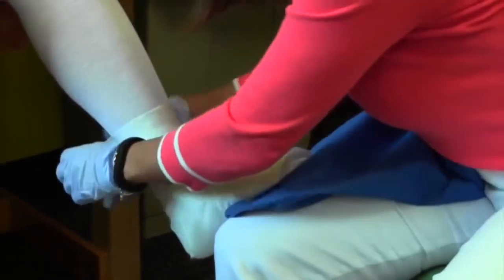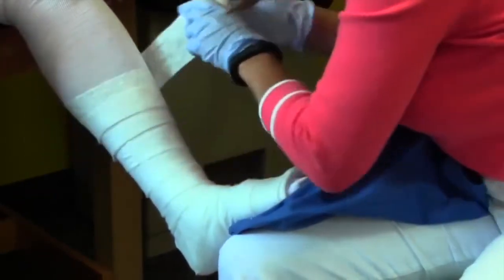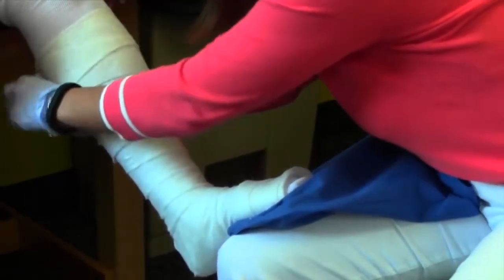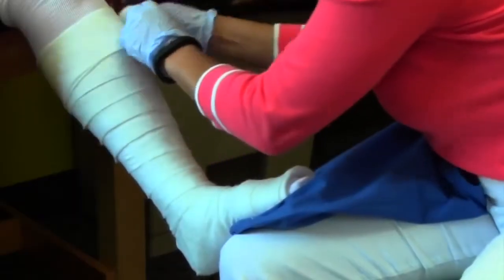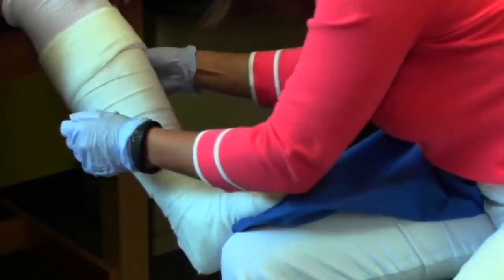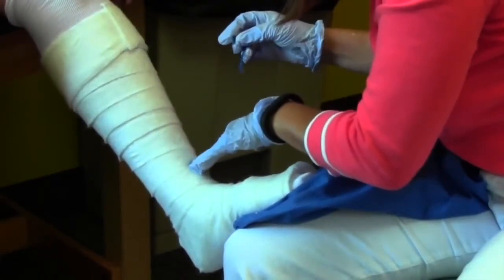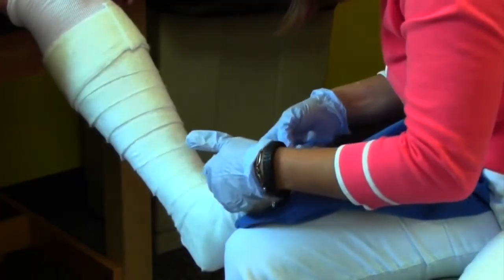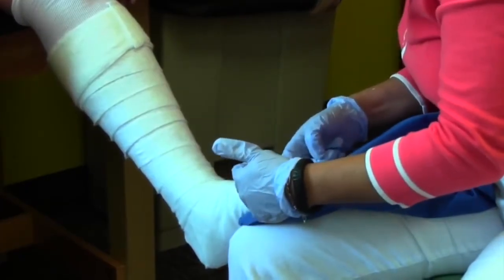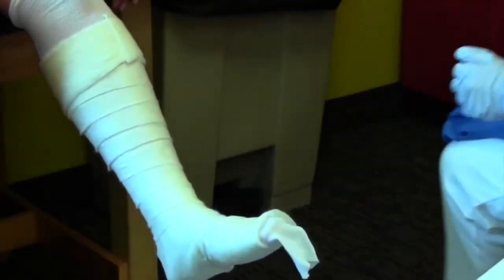So the padding, other than in those three areas, should be about 2 layers thick, not excessive. At the ends, you put 3 or 4, however many you think you need. The fracture in this case could be anywhere between the very distal tibia, the heel, the talus, or the midfoot, even a metatarsal base fracture. If I had something more toward the metatarsal heads, I'd probably come out even further past the ends of the toes, just to support those toes a little bit better.